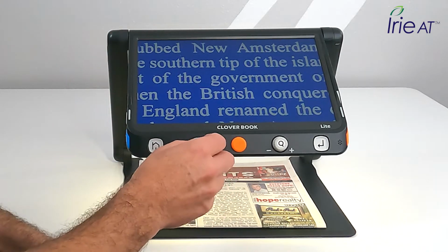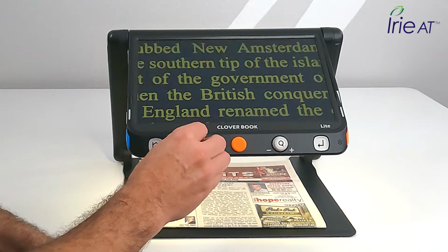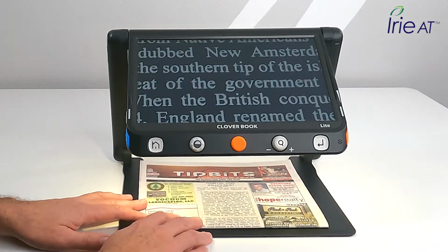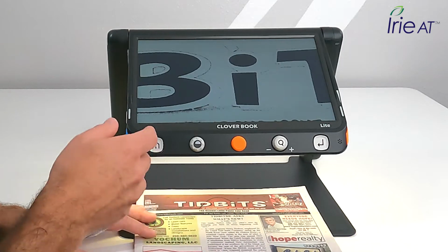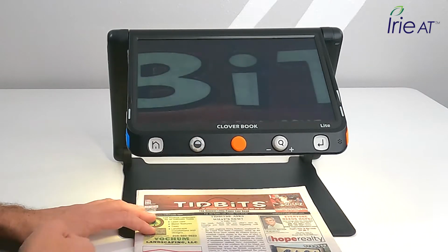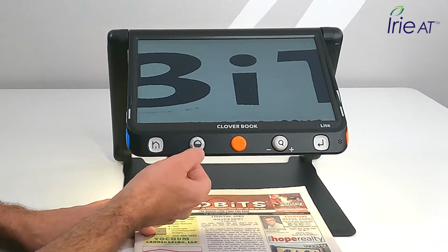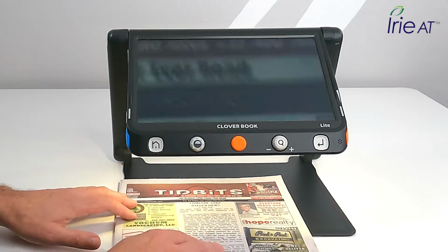Plus just in regular function, what you're going to do, I'll get back to mine. I like my white on black. So I got my white on black. What I'm actually going to do is I'm going to read this in this color, and then when I get to something that needs to be color, like a photograph, or I'm doing something I need more depth of field, I'm just going to quick press that button that's in the middle of the contrast wheel, and that'll switch me quickly between my favorite contrast color and full color. It makes it real easy if I have a photograph.